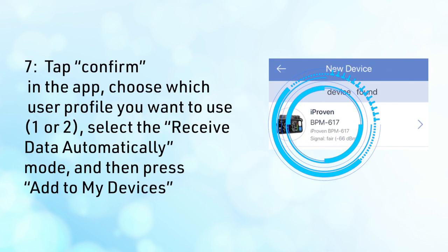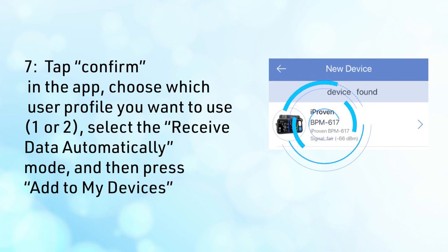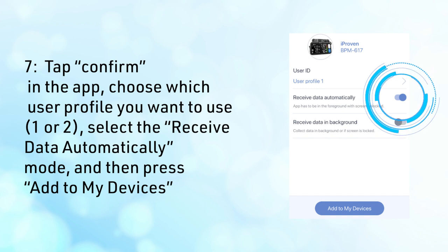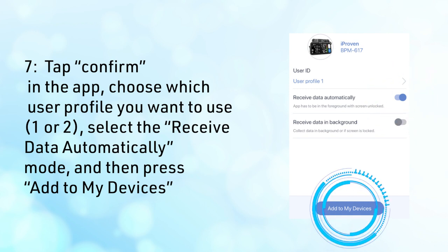Seventh, tap Confirm in the app. Choose which user profile you want to use, one or two. Select the Receive Data Automatically mode and then press Add to Devices.